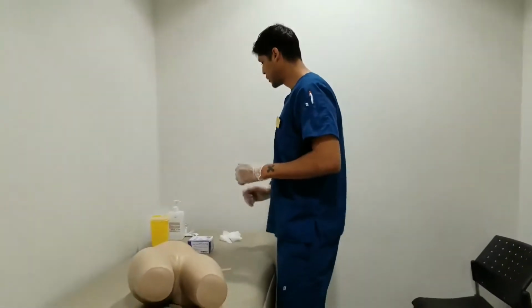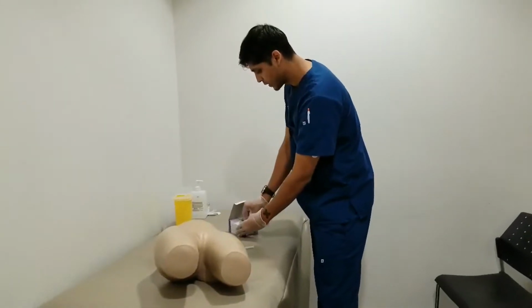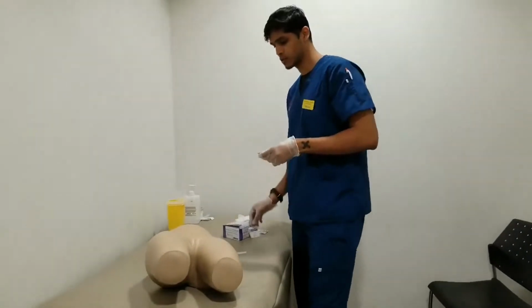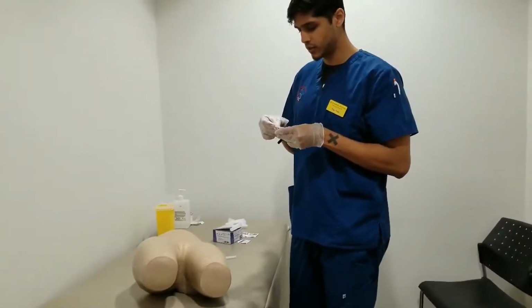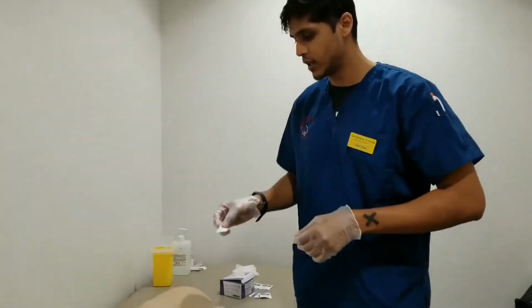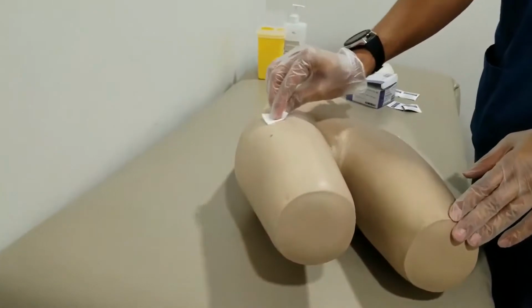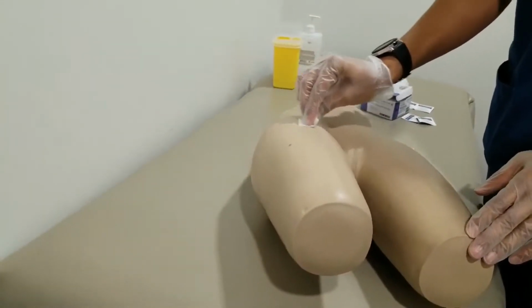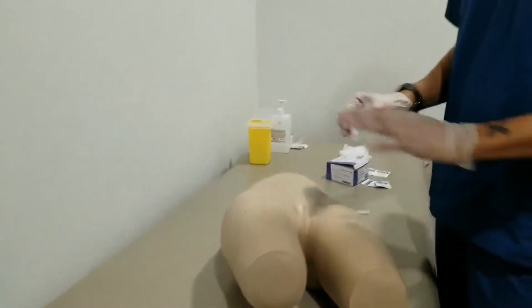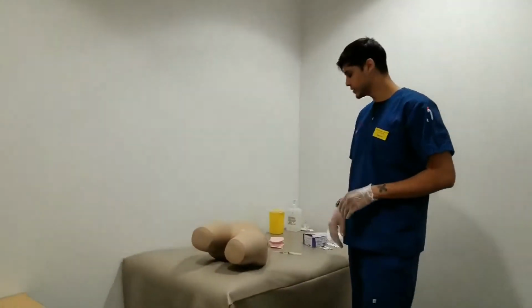injecting into there. And prior to injecting and finding the site that I want to inject into, I will clean the site with an alcohol swab. It would be nice if we can clean the area for about 2 minutes, but I'm going to go for about 10 seconds going in a circular motion around the site that I chose. Moving slowly away from the center. Okay. I'm going to let that dry. I'm going to toss away the alcohol pad. In the meantime, letting the area dry.